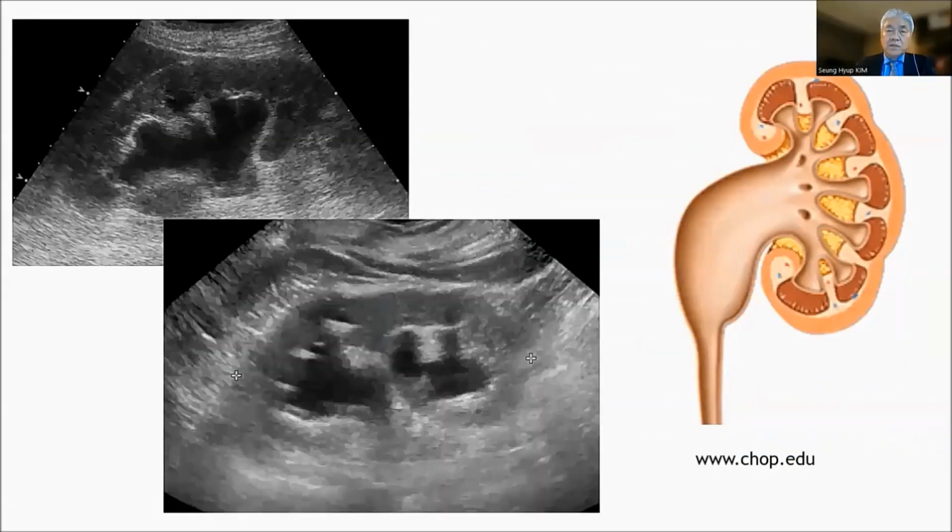It is easy to make a diagnosis of hydronephrosis when we see dilated renal pelvis and calyces as continuous structures. And if we identify the relationship between the hypoechoic renal medulla and the end of dilated calyceal tips, it is helpful to confirm that these are dilated calyces. This close relation between the calyceal ends and the hypoechoic medulla may help differentiation between hydronephrosis and parapelvic cysts.